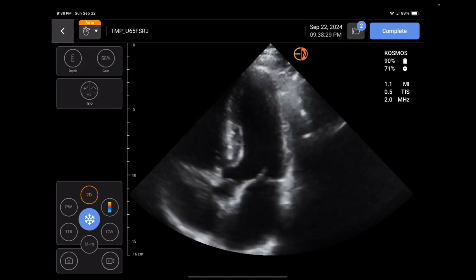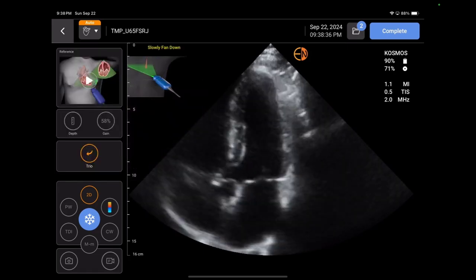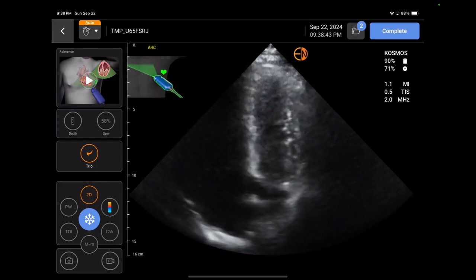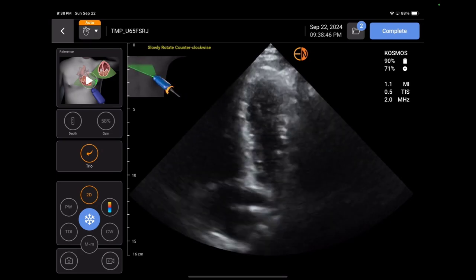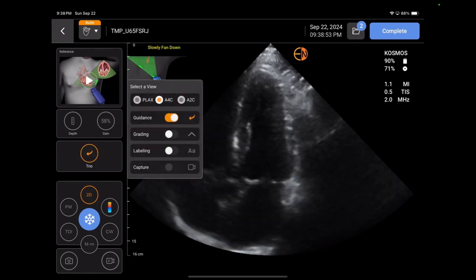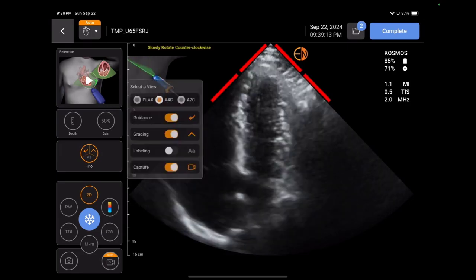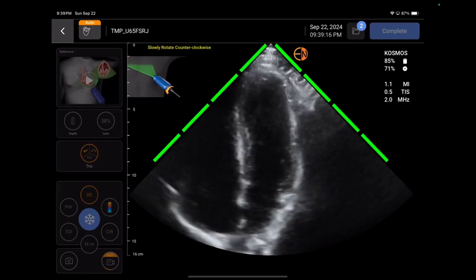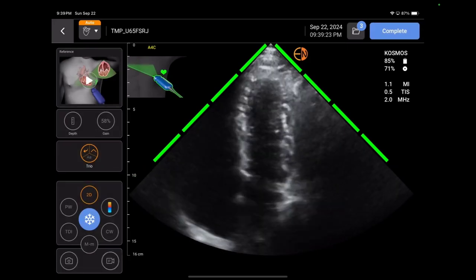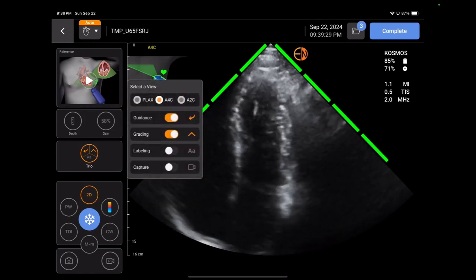You have the trio button here just like before, but you change it to the apical four. You turn on the guidance and it tells you what to do. Now I already have a great view — it says I'm in a five chamber view, so it tells me to fan down a little bit. The heart comes up, and as I had a good view, it says great view. If we turn on the grading, it can grade here — there's my four chamber and it says it's great. Then it can auto capture once I get a good image. You heard the little bing of it auto capturing after I got a good image — it didn't even have to wait. As soon as I got a good image, it auto captured. That AI feature is really cool.